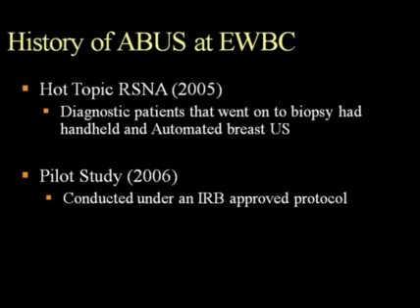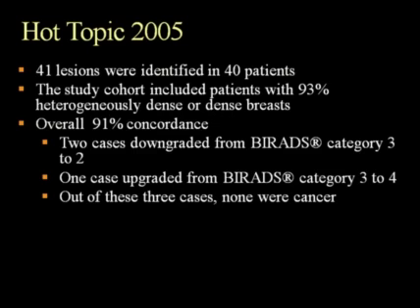The history of automated breast ultrasound in our facility at the Elizabeth Wendy Breast Care: it started several years ago. We presented a hot topic at the Radiological Society of North America in 2005. These are patients that went on to biopsy, and we did handheld ultrasound, the standard ultrasound, and also automated breast ultrasound. We also followed up with a pilot study in 2006, which was conducted under IRB approval.